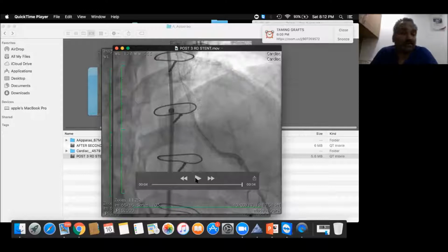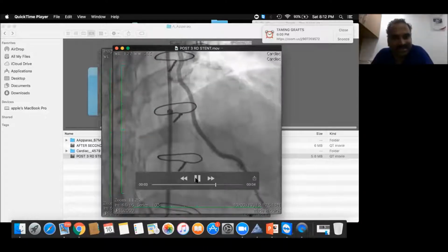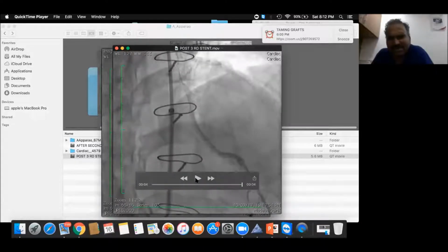But because of the loops shifting and accordioning, that shows something like a lesion at the end of your stent. Whenever that happens, your second stent should cover all the loops. Never take a short stent. That's a learning point from this case for me. I did it almost 6 months back. He's doing fine, and we are planning a retrograde angioplasty for RCA next month for this guy.